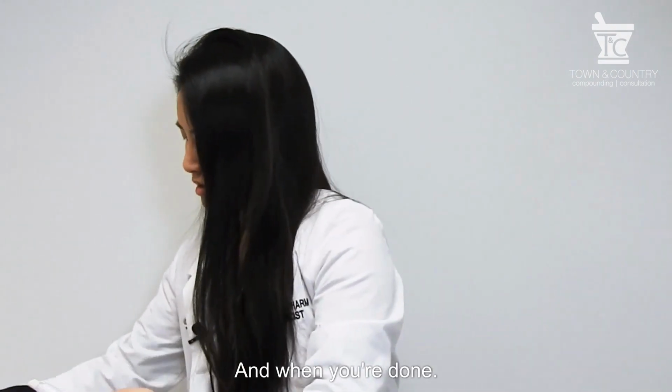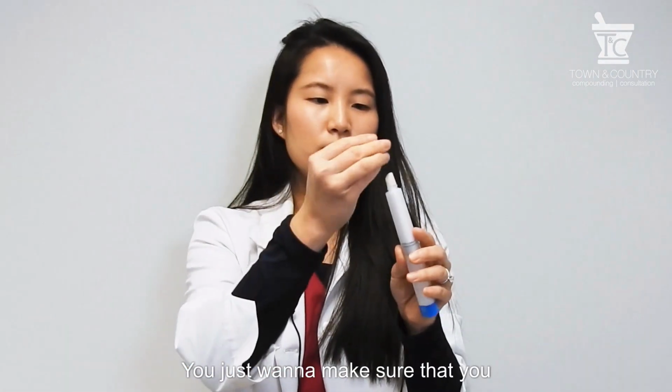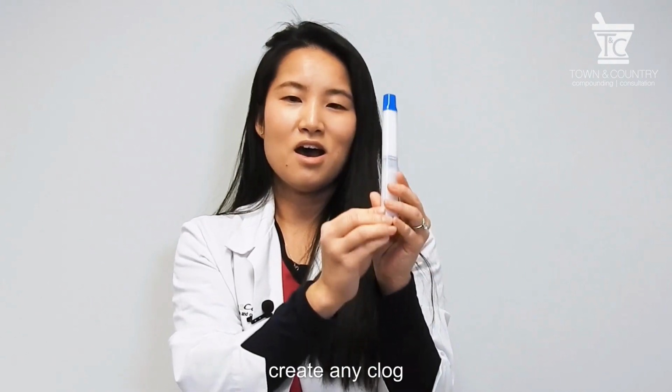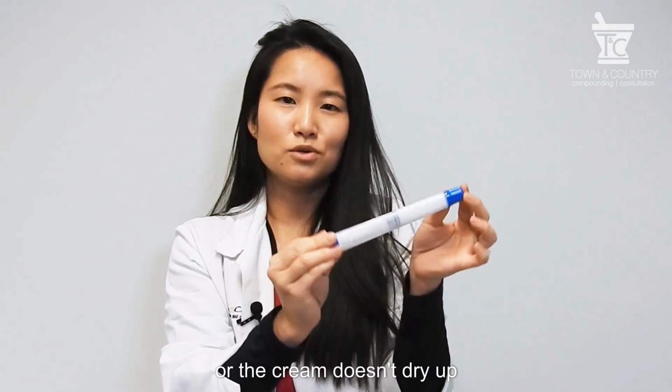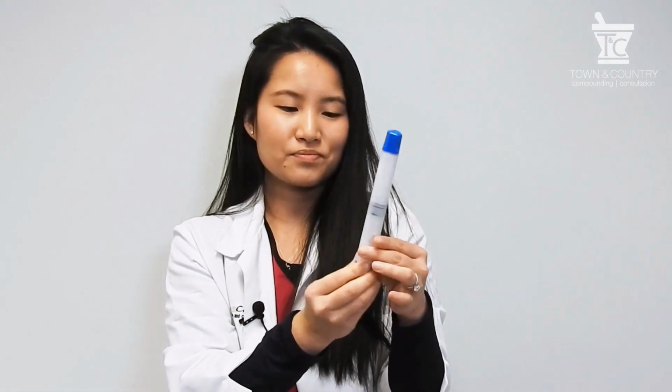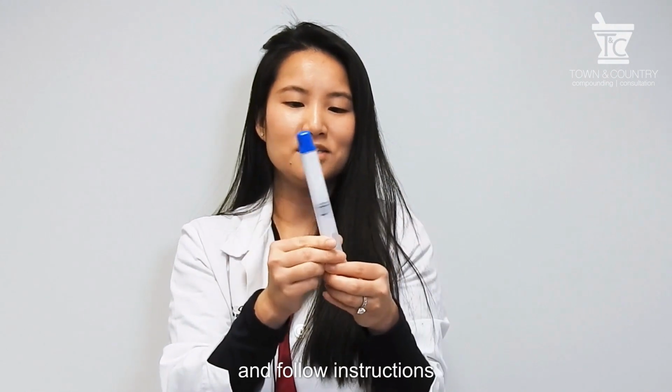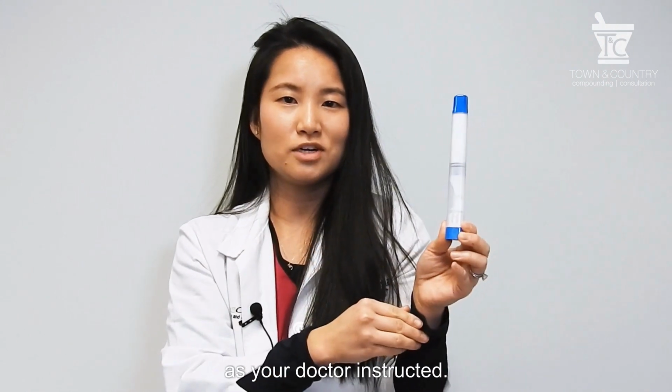And when you're done, you just want to make sure that you screw the cap back on securely so that it doesn't evaporate or create any clog, or the cream doesn't dry up in the opening. Make sure you read all your storage labels and follow the instructions as your doctor instructed.